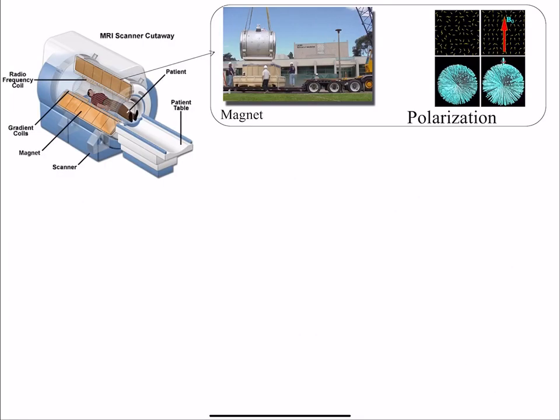Okay, so that's sort of an overview of the hardware. And so now what we're going to do is start talking about how each of these components works and what they do. So what we have is the magnet. We're going to find, yes?